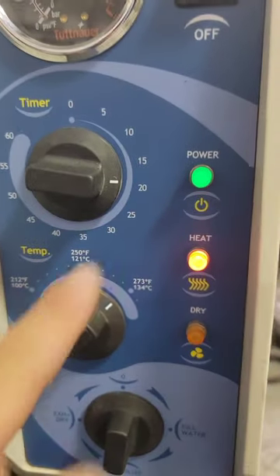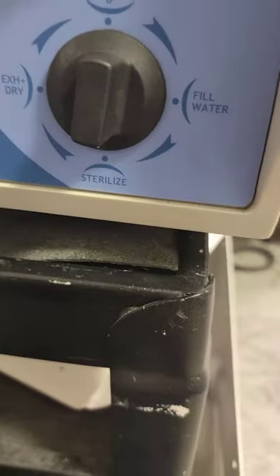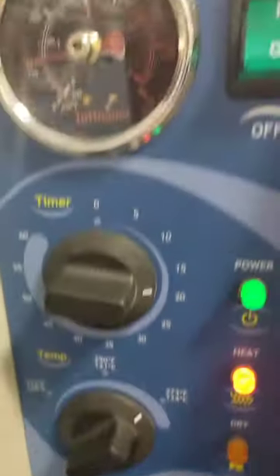Our cycle is running. The timer is still going — it's not really doing anything yet, just giving us power in heat-up sterilizer mode at the desired temperature. We're heating up. No water leaks, no steam leaks — I replaced the seal, so we're looking good.